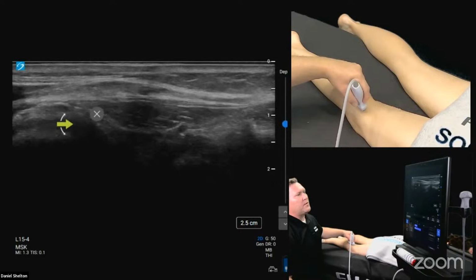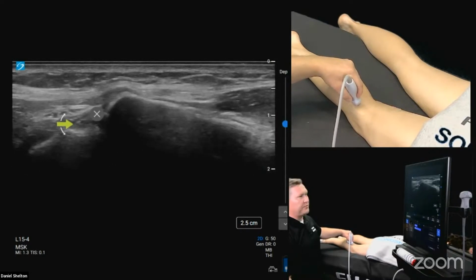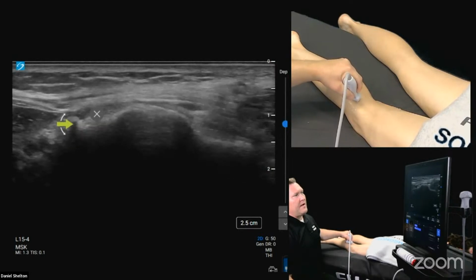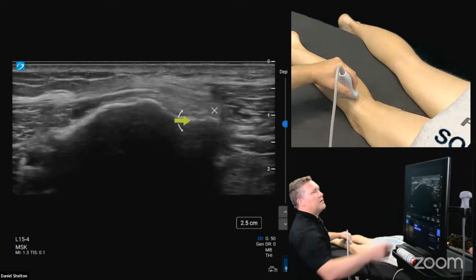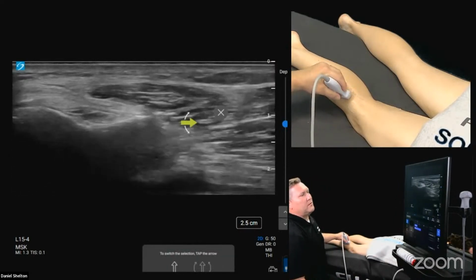Okay, so let's keep following that peroneal nerve up to the fibula again. If you see fibula in the shot, you're not posterior enough. So slide a little bit more posterior. There you go. And then after the fibula, you see the fibular neck start to come in down here. And that's where you have to rotate the transducer and you'll catch where the nerve decides to split.